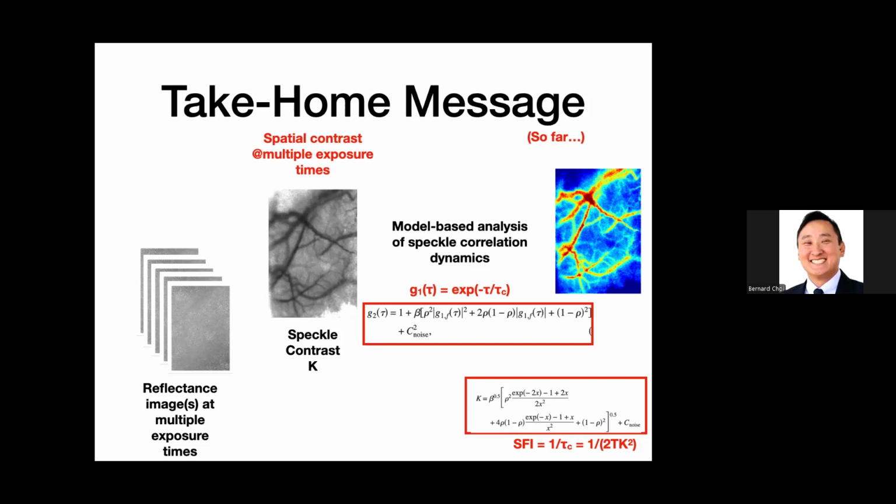Now one of the jokes we have in the lab is we call it the Creuset limit. Christian's been working with this system in particular with a very feeble number of counts, like 10 counts with 250 on an 8-bit camera, and it still worked remarkably well. Speckle is an extremely forgiving technology, especially since all you care about is relative dynamics, and you don't necessarily care to be this quantitative. It's actually pretty forgiving.